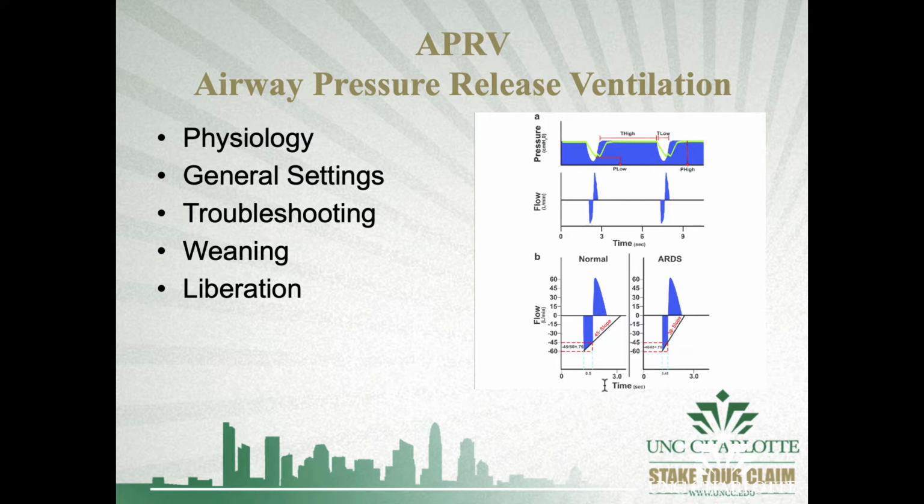And you kind of oscillate around those pressures with your spontaneous breathing, and then you have a pressure release to augment some sort of tidal volume, right? If you think of a balloon pump, the way a balloon pump works, during diastole you have an inflated balloon pump, and during systole you have a deflated balloon pump. It's kind of the same thing, you're augmenting that tidal volume. But with APRV, you need to have a spontaneously breathing patient. You don't necessarily need to, but the ideal patient is spontaneously breathing.